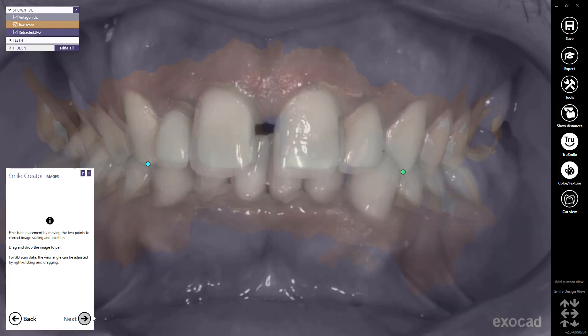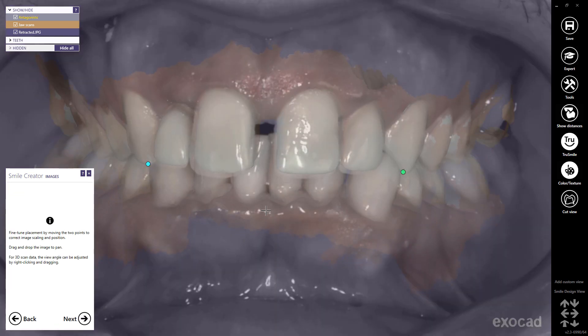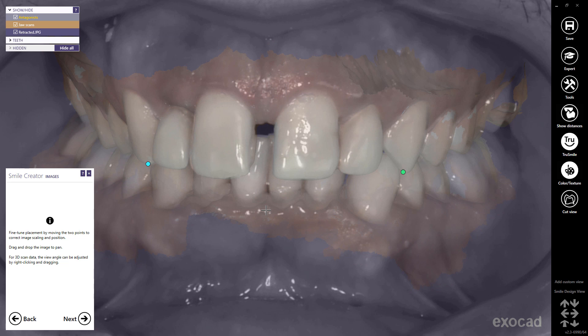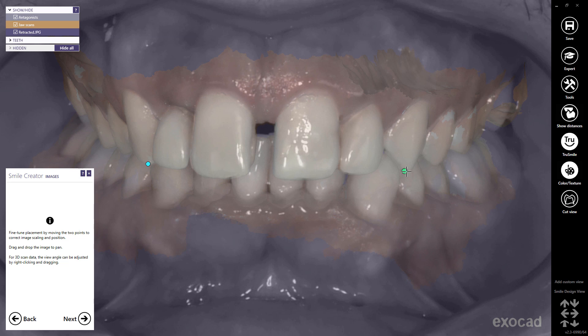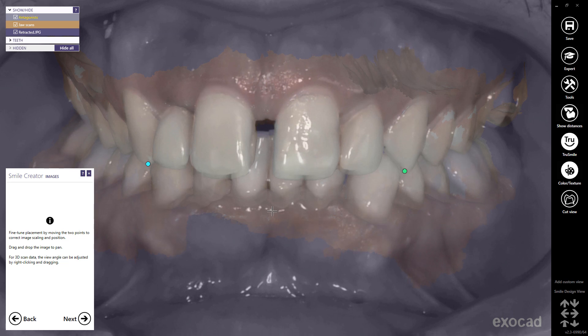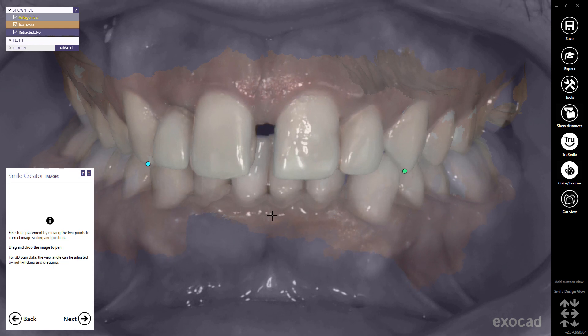For 3D scan data, the view angle can be rotated by mouse right-click and dragging. Fine-tune the placement by moving the two points to correct image scaling and position. Drag and drop the image to pan. Note, the accuracy of this placement is not critical and is mainly for aesthetic preview. Proceed to Next.